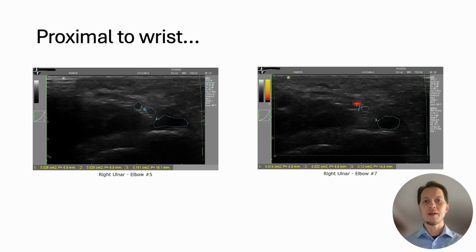Now, we do get a lot of ulnar neuropathy at the elbow here where I work. Don't get too much wrist by comparison. So that wrist, especially that injury and the hyperextension, and then just years of ulnar wrist bothering her was really bothering me. And I wanted to flesh that out and search a little more.